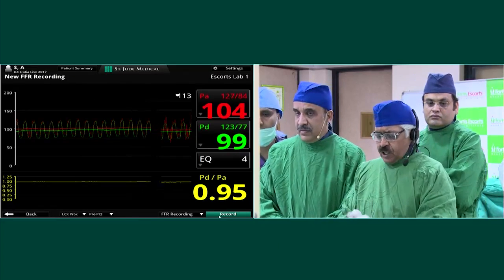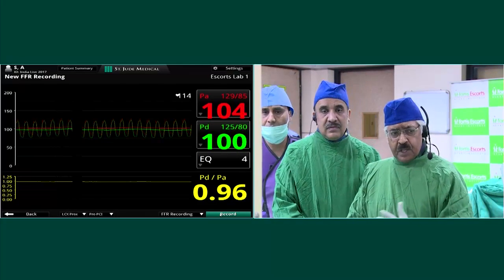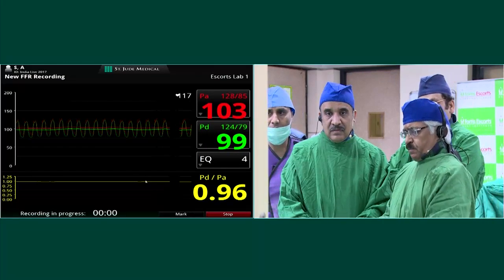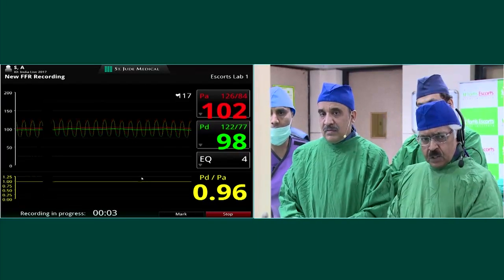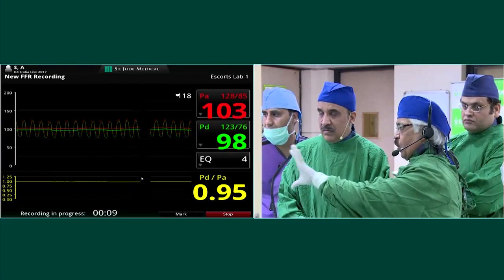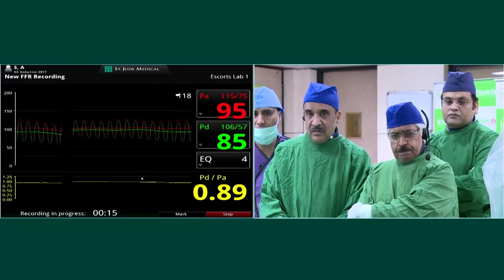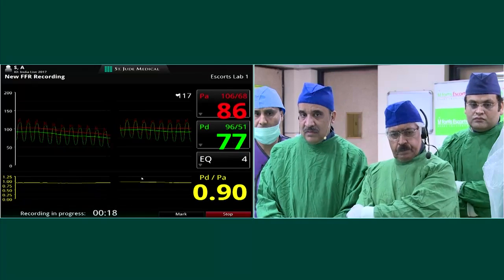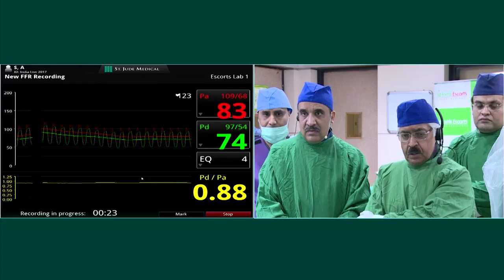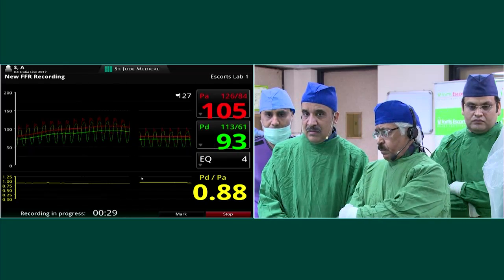I think it's a very great discussion. Why we've got less time to show you the stenting. I was not taken by surprise by the RCA, which was a borderline stenosis, but I'm totally taken by surprise by the circumflex. So we're again infusing. We've given nitro. You should start seeing the FFR, I hope. You're seeing the FFR there. 0.89. We're 36 seconds into infusion, and we gave nitro as well, so we got maximal vasodilatation.